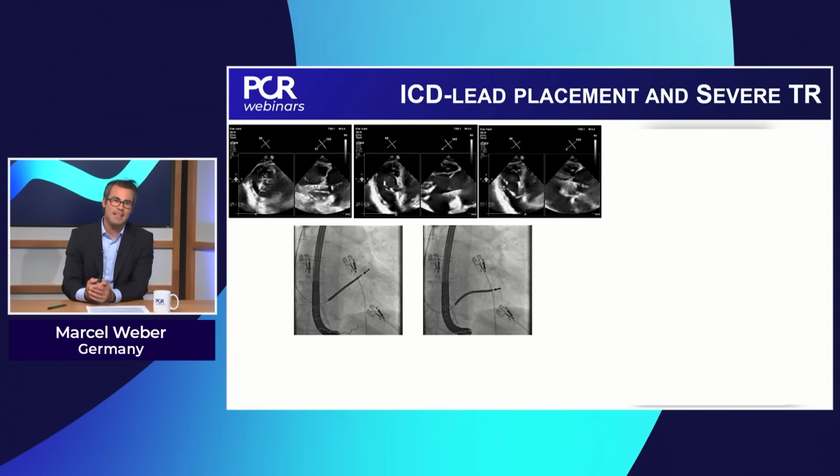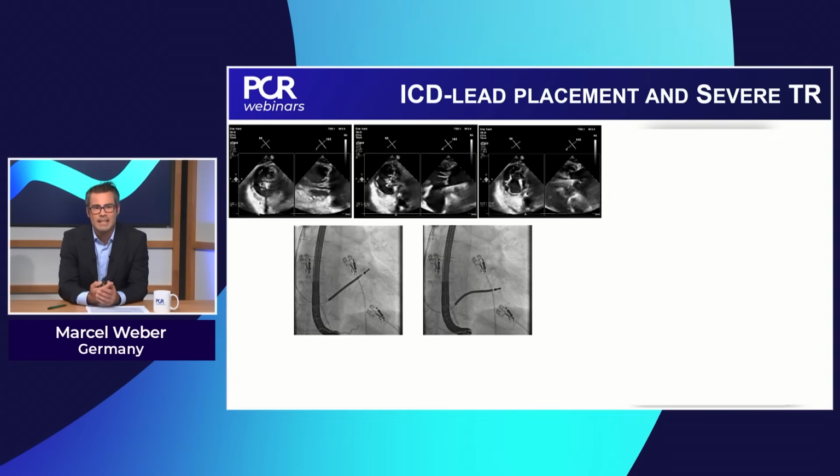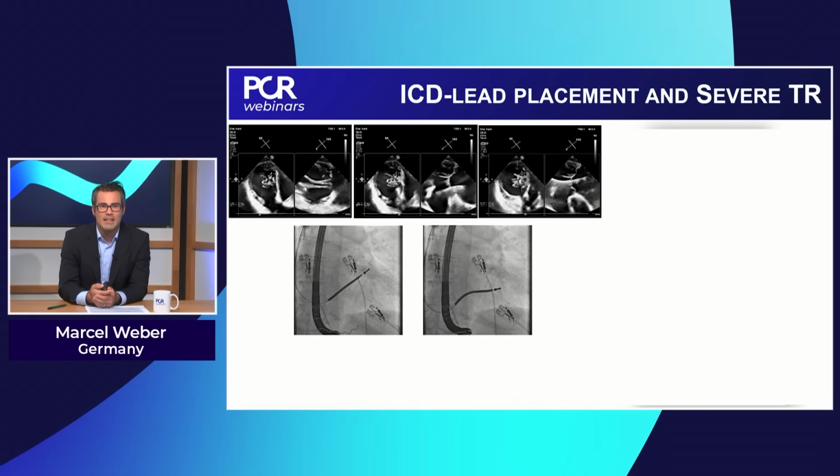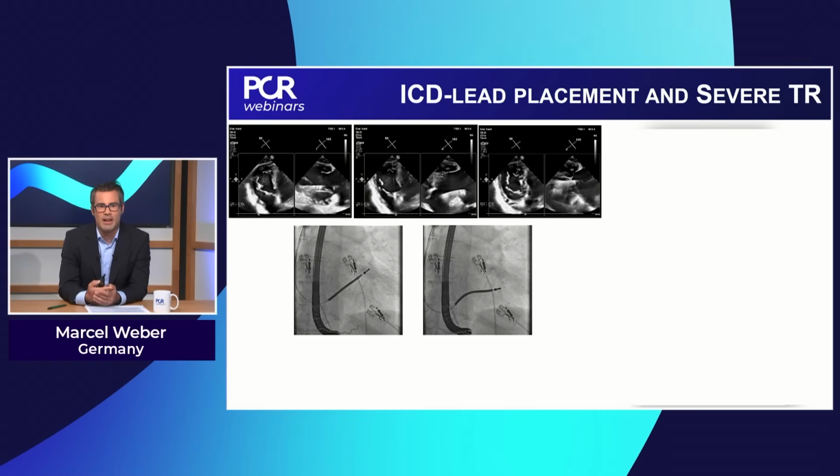So you can see here different lead placement maneuvers. On the left upper image, you see the lead going just into the middle of the valve, to the middle of the right ventricle.